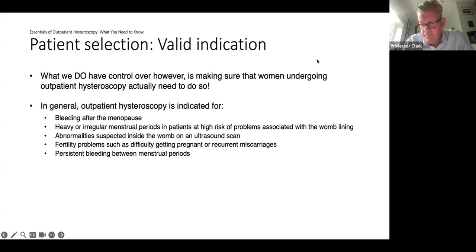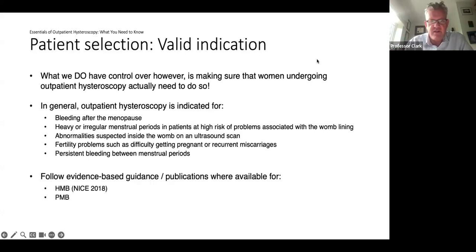So things like uterine septums. And some women do get acquired issues around scarring, so intrauterine adhesions, and the worst case scenario, Asherman syndrome. And again, the outpatient setting can be useful for either treating more minor adhesions or for making a more thorough assessment of the degree of adhesions that are present.